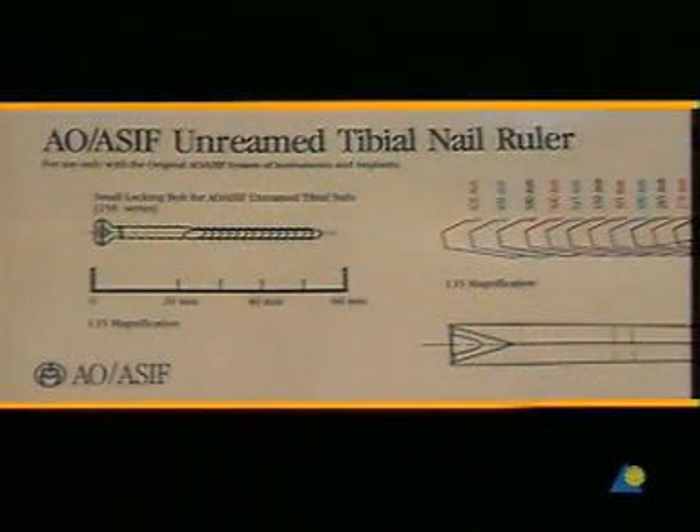To determine the required nail length, the special transparent template is available. This is placed on the x-ray of the uninjured tibia, and the exact length of the nail can be read off the template.